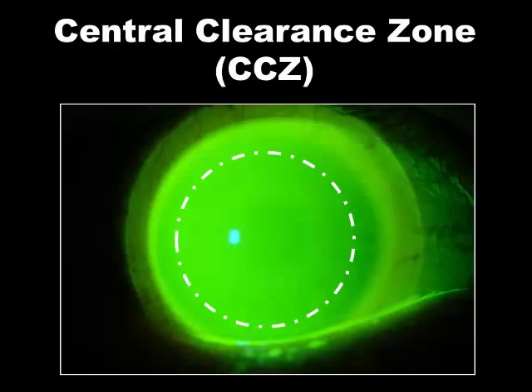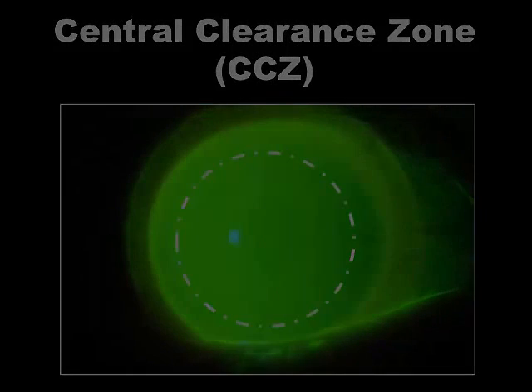If you see any corneal bearing, you know you need to go higher in elevation. So if we have a 4200 micron lens on eye and it's touching, we should go up by at least 300 microns, maybe 400 microns higher.